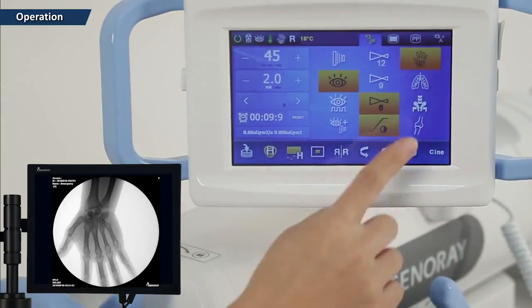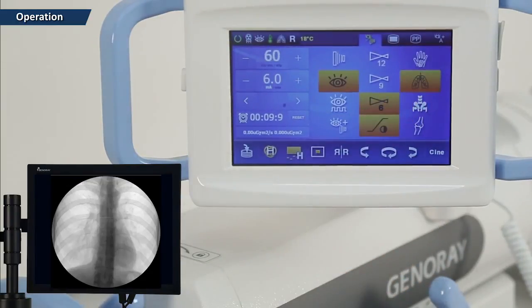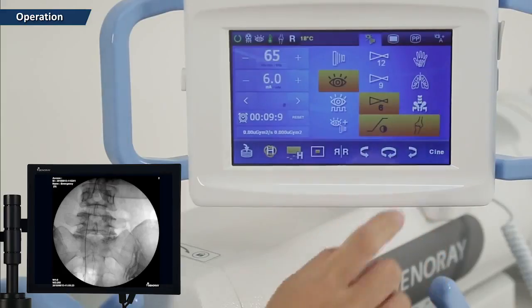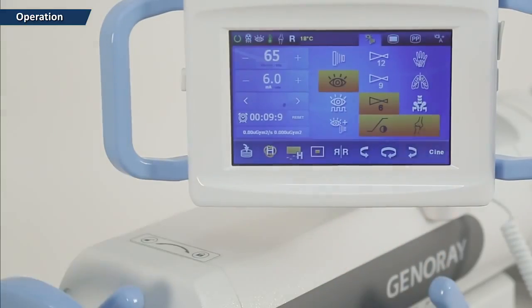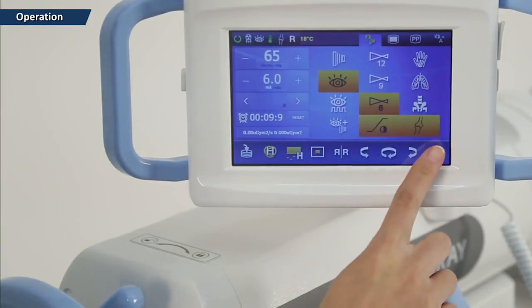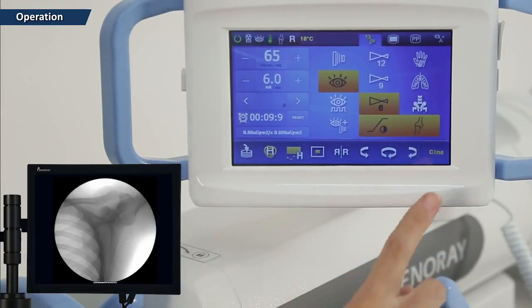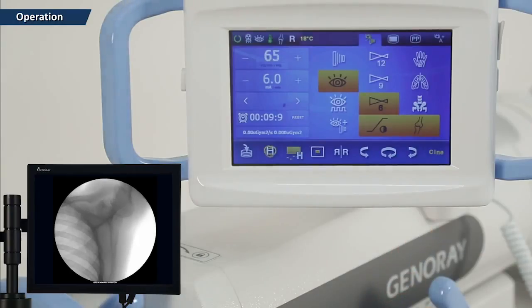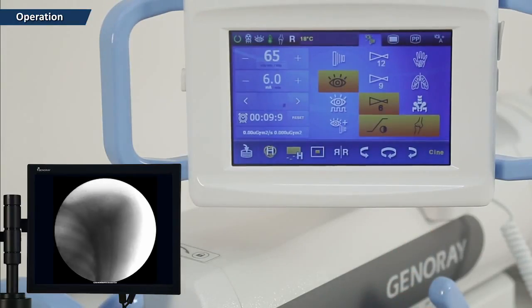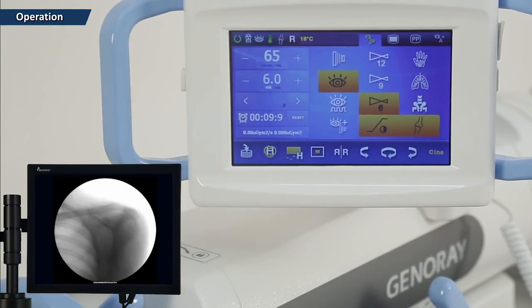It will be easier to prepare for filming when the filming part mode is used. When filming after pressing the cine function button, the video function is automatically activated, allowing storage as a video clip.